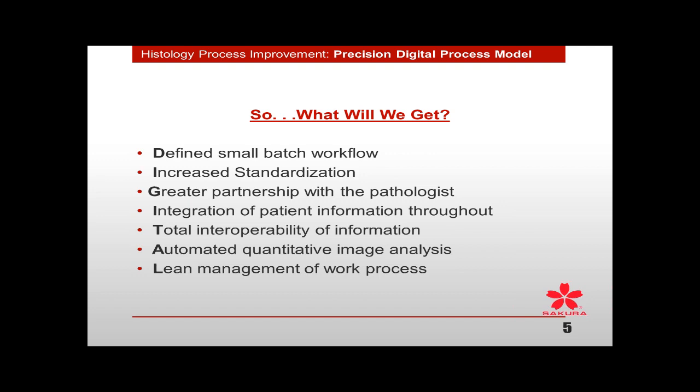So you're really going to have to also have a lean management of your work process. You've got to make sure that it moves in a very smooth and consistent, but in the most correct flow, so that you can effectively and appropriately work with the materials that we have, which are tissues, blocks, and slides, to convert those to digital data that can then be delivered to the pathologist in a combined way of glass slide and digital image to give them more information, which ultimately allows us to enhance the diagnosis and the patient result.